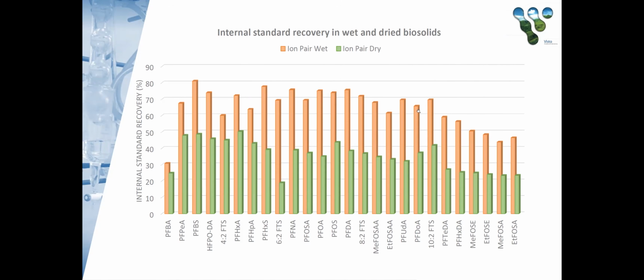And perhaps some more research needs to be done on how to improve this and to get reproducible results. But in this study, at least, it seems like processing a wet biosolid sample yielded better results and offered greater extraction efficiency.